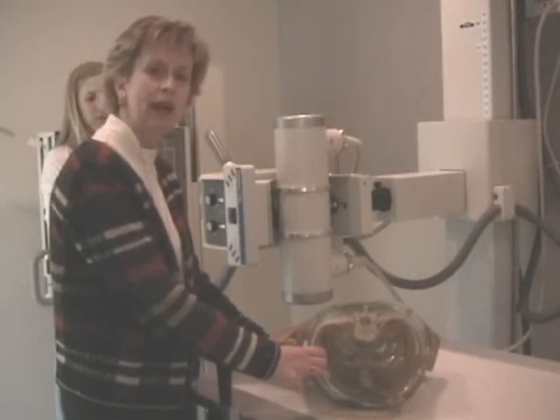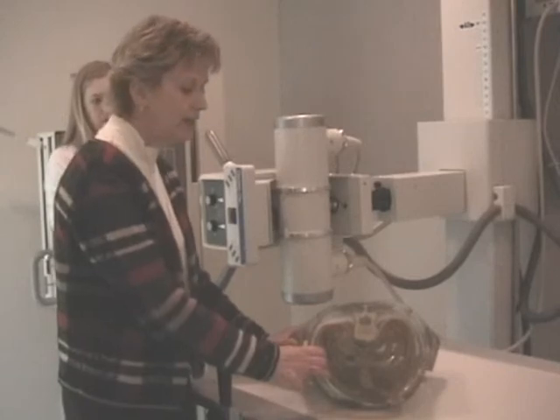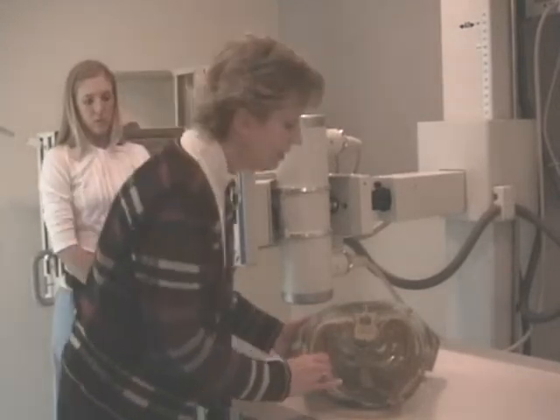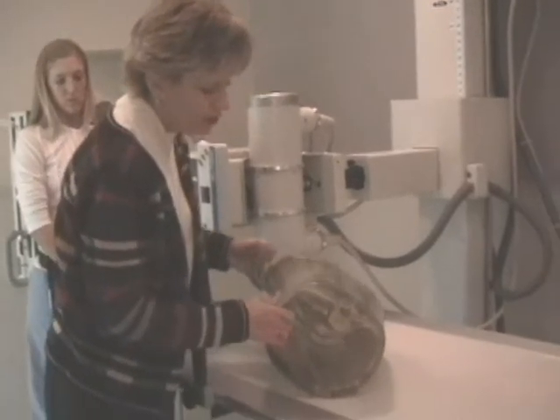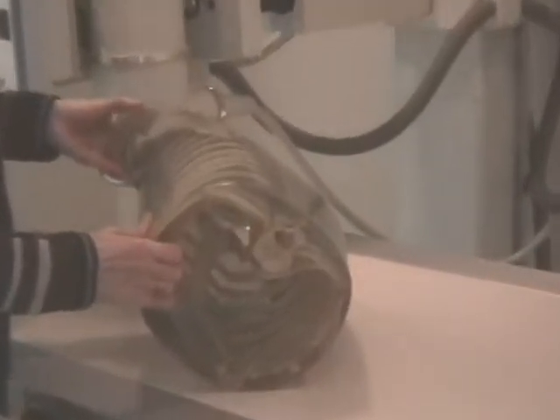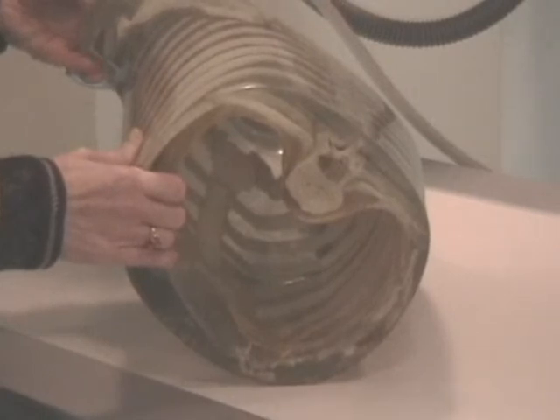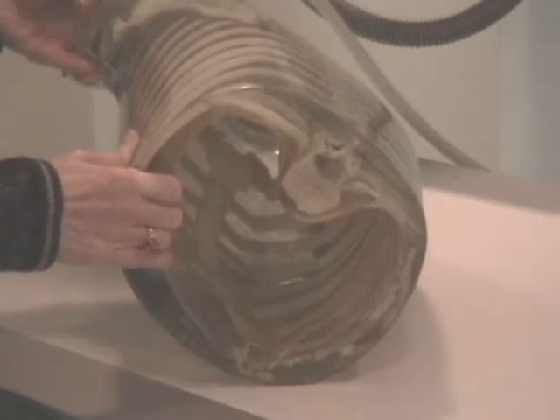You're actually going to be after the away side. The criteria reversed. Away side. Let's demonstrate why. Okay? What position is the patient in now? The patient is in an RAO position. Right side closest to the film, anterior side closest to the film.